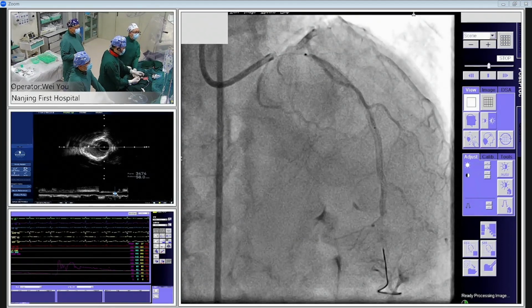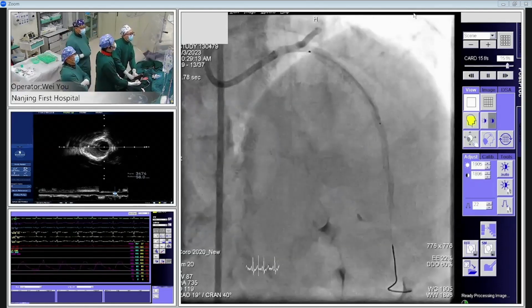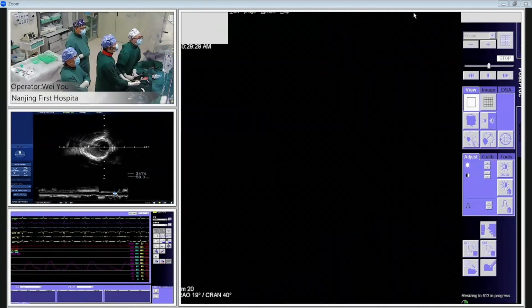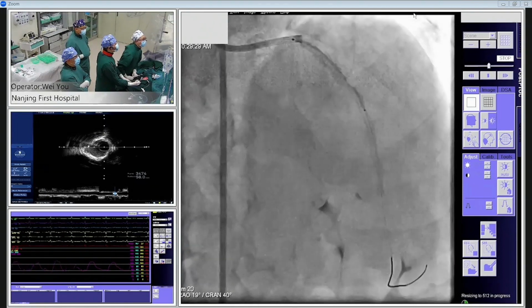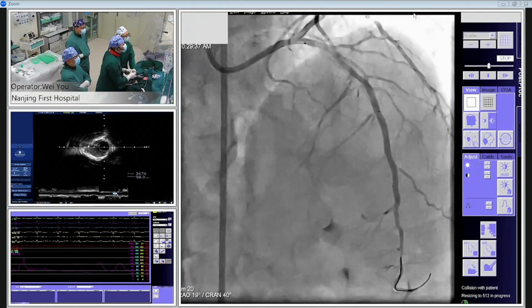Okay, Chief, we overlap nearly 4. Do we need to retrieve a bit more? I think we should pull back a little, to avoid overlapping at the septal branch. Okay. Maybe we lost it. More proximal, yeah. Okay, here is good. Picture again. Picture, please. Okay, just here. Good.